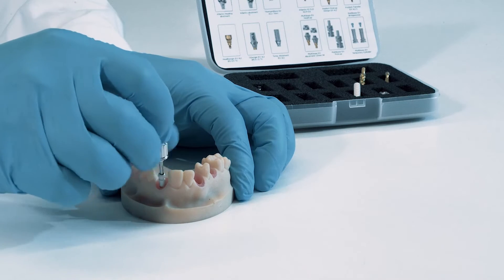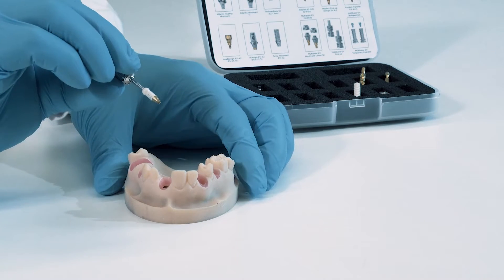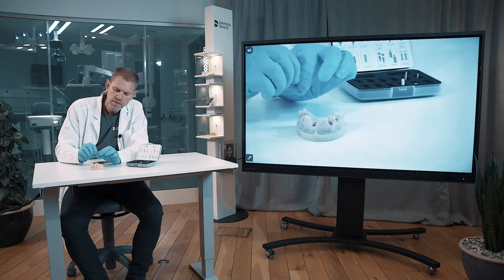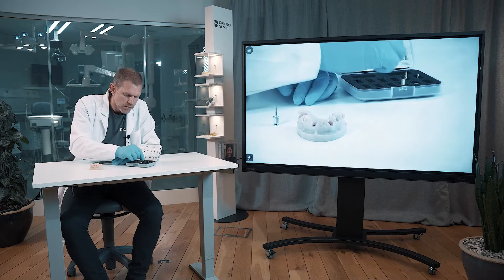Releasing is also very easy and convenient, and you can lift it out in one piece and put it back.